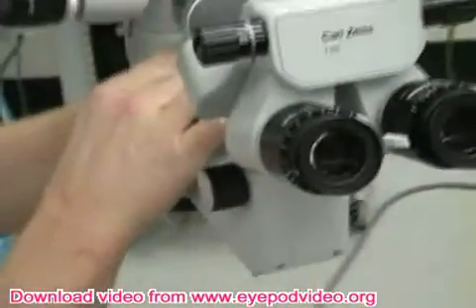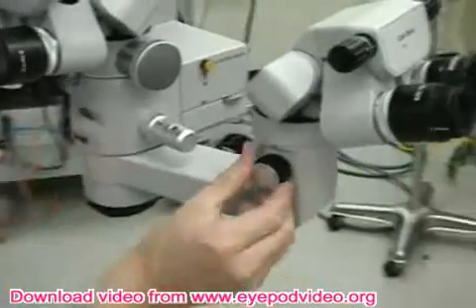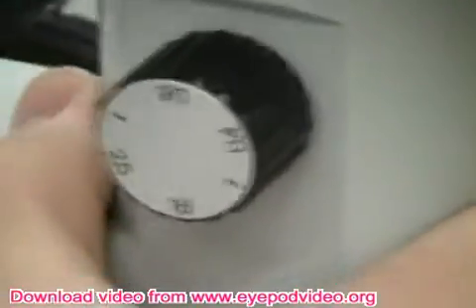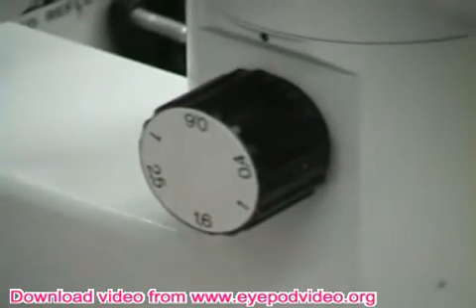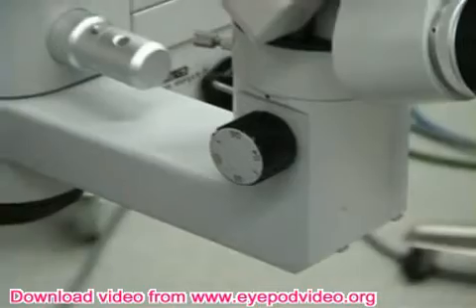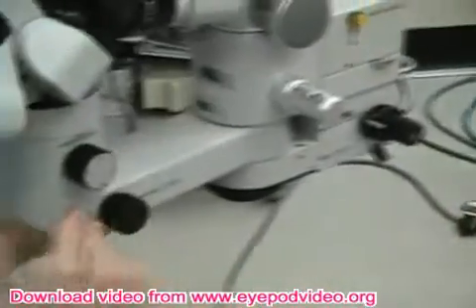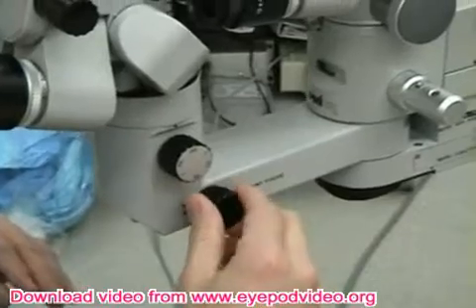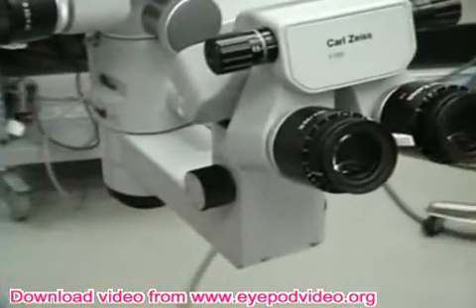The assistant has a separate mag switch. You can see fixed at .4, fixed at .6, fixed at 1 — so the assistant has a different zoom than you have. Now as the microscope moves up and down, the assistant will have a similar focus to you. Usually as the surgeon moves the focus down or up, the assistant's in sync. But there is a separate focus knob here that helps the assistant if there's some difference in accommodation or something.